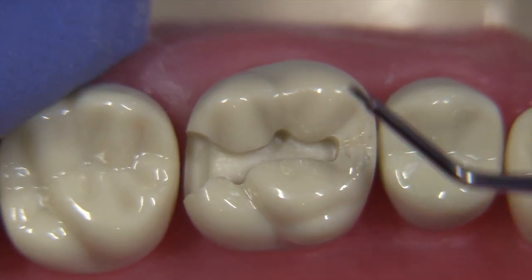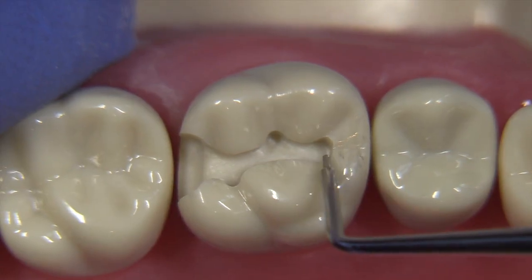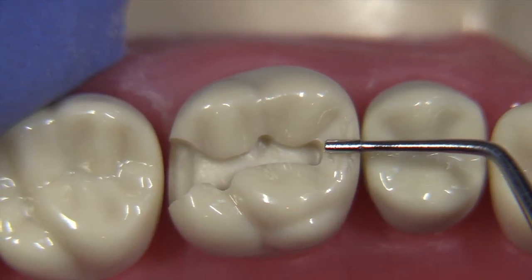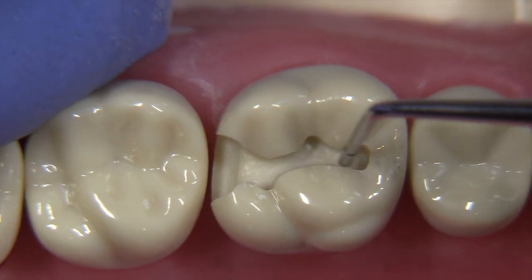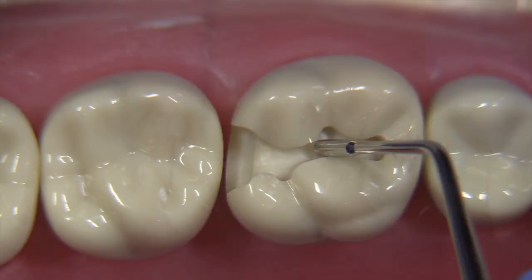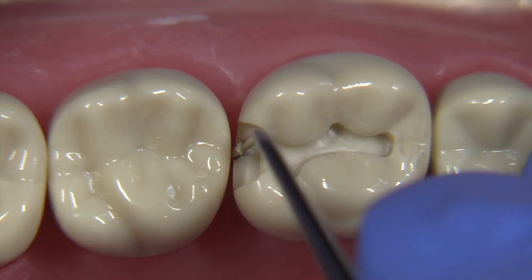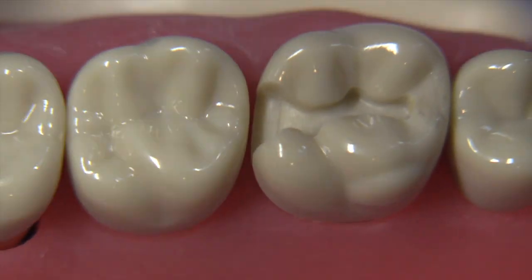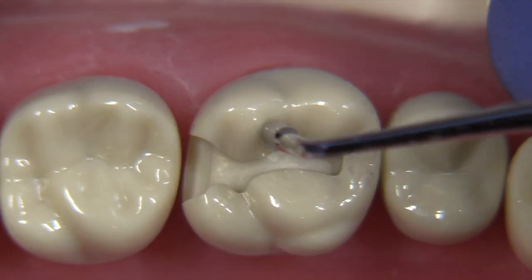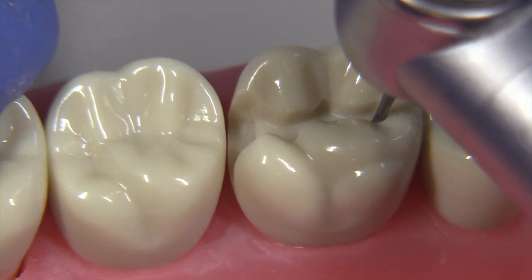You can see that we've smoothed off the preparation pretty well - we have a little bit more smoothing to do. We're looking at the distance between the mesial wall and the proximals and we can see about two millimeters of remaining marginal ridge. Contact is broken, you can see one millimeter wide in the isthmus area between the mesial angle and distal buccal cusp, and we're somewhere between 1.2 and 1.4 millimeters - less than 1.5 - on the axial.